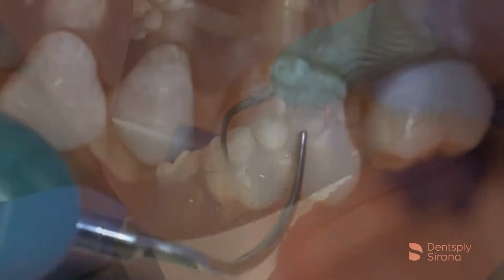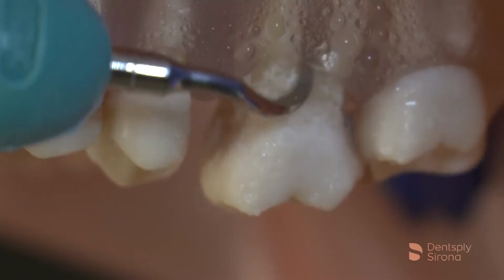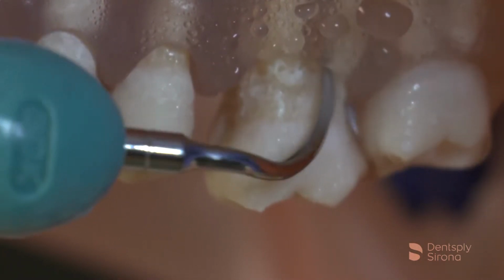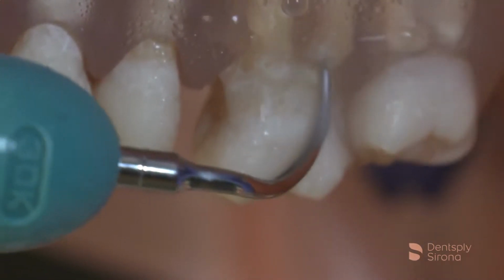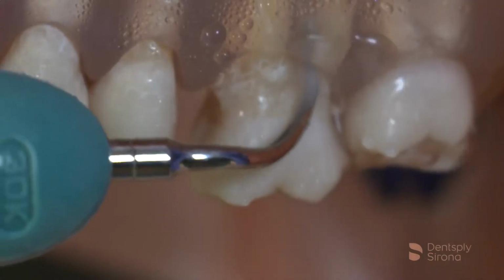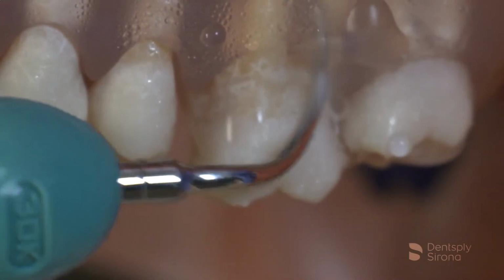Navigating the pocket, assess while entering and engage any deposit encountered with a gentle tap. Frequent, methodical, overlapping strokes are essential in the periodontal pocket to detoxify and debride every square millimeter. A haphazard approach will leave deposit and biofilm behind and limit the patient's response to therapy.